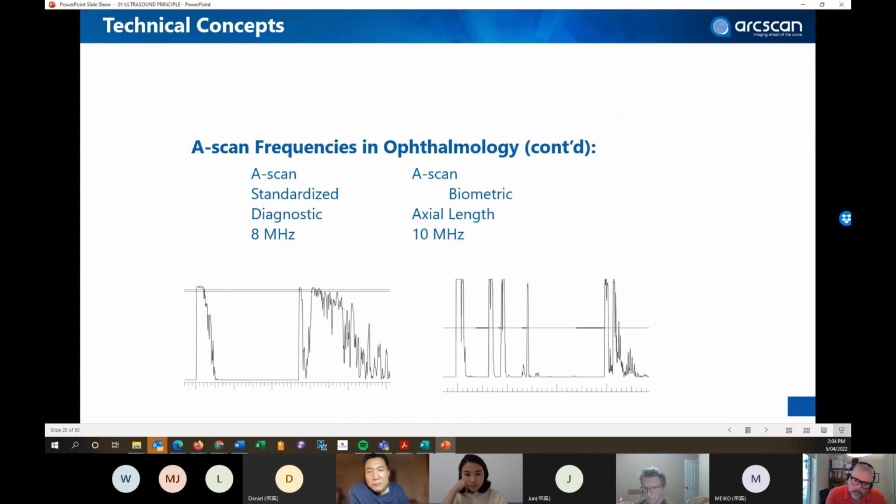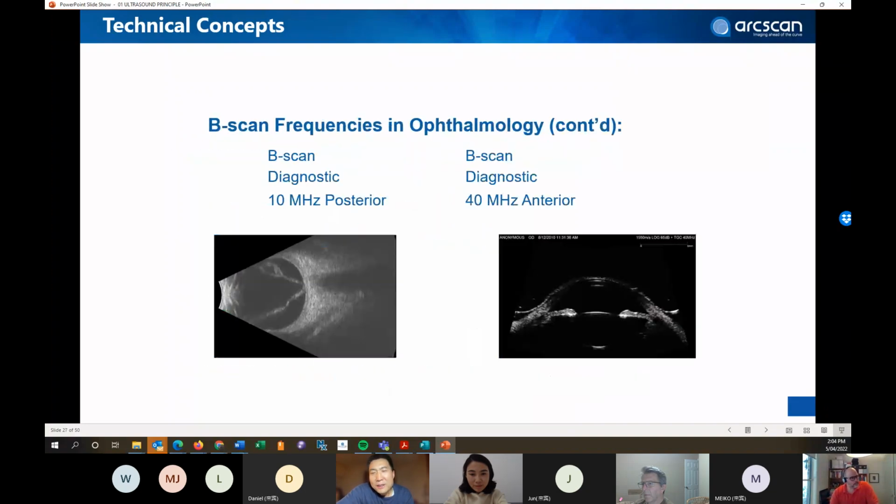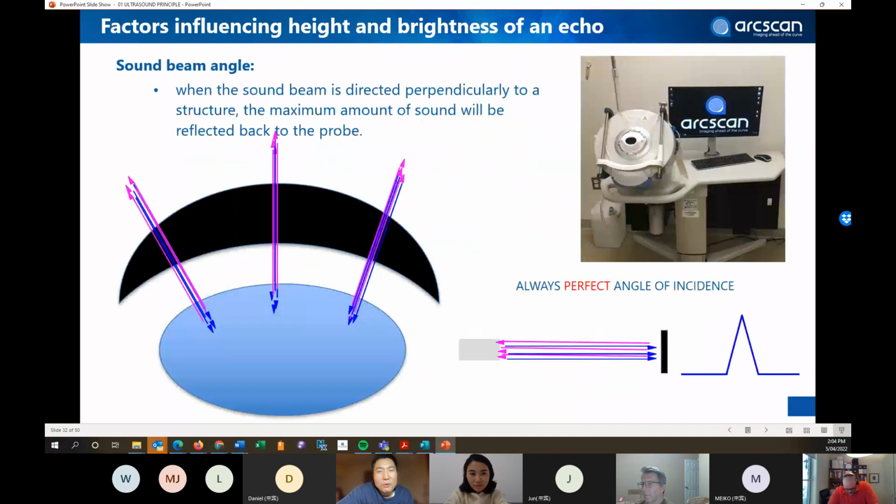So, Rick, thank you very much for such a nice talk. I think it gives us very basic information about ultrasound. I don't think any of us really understood before you gave us the talk. So, my question for you is, when we talk to physicians, we compare with Quantel, and they have the same frequency, like 50 megahertz. So when a physician asks why you think your image quality is better than theirs, we have to have some fundamental reason to explain to the physicians, right?